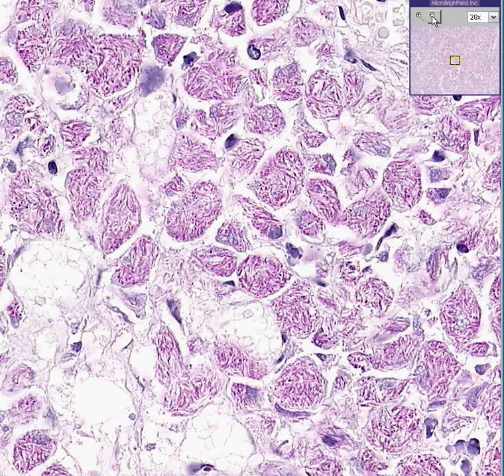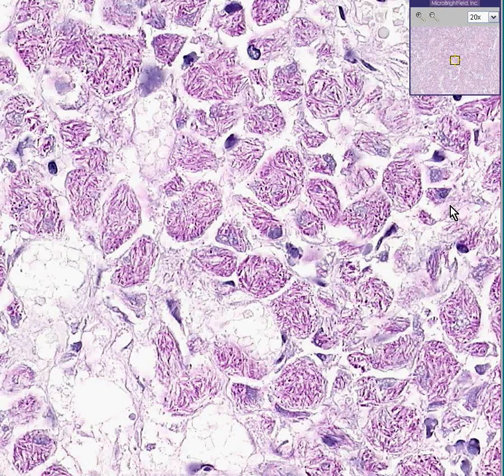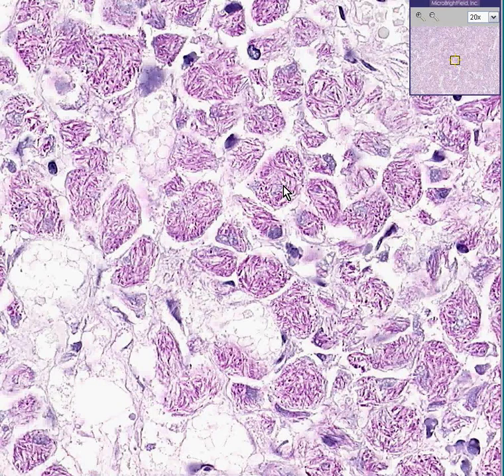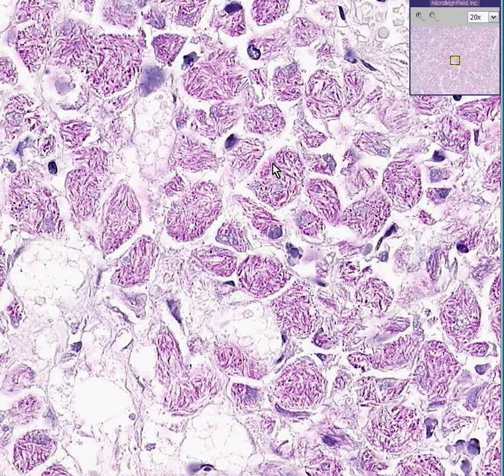We don't have the H&E stain to go with this, but if we did, we would see all of these small cells as probably being lymphocytes. We might also see that the majority of the field looks like cells with a bunch of foamy cytoplasm without anything really distinguishable inside. But when you do the acid-fast stain, you can see we are staining acid-fast bacteria. Thank you very much.